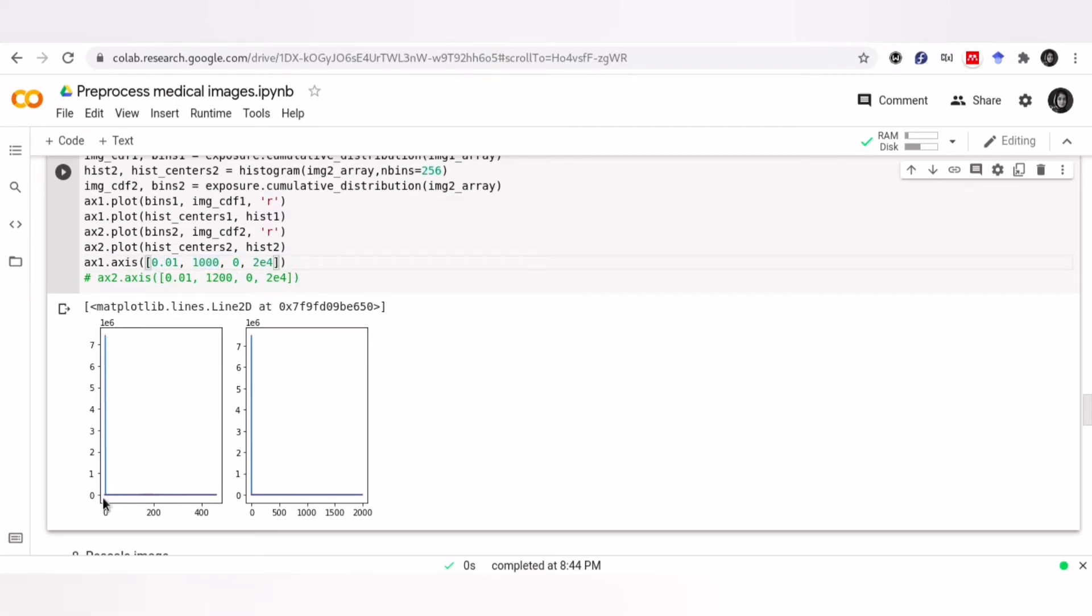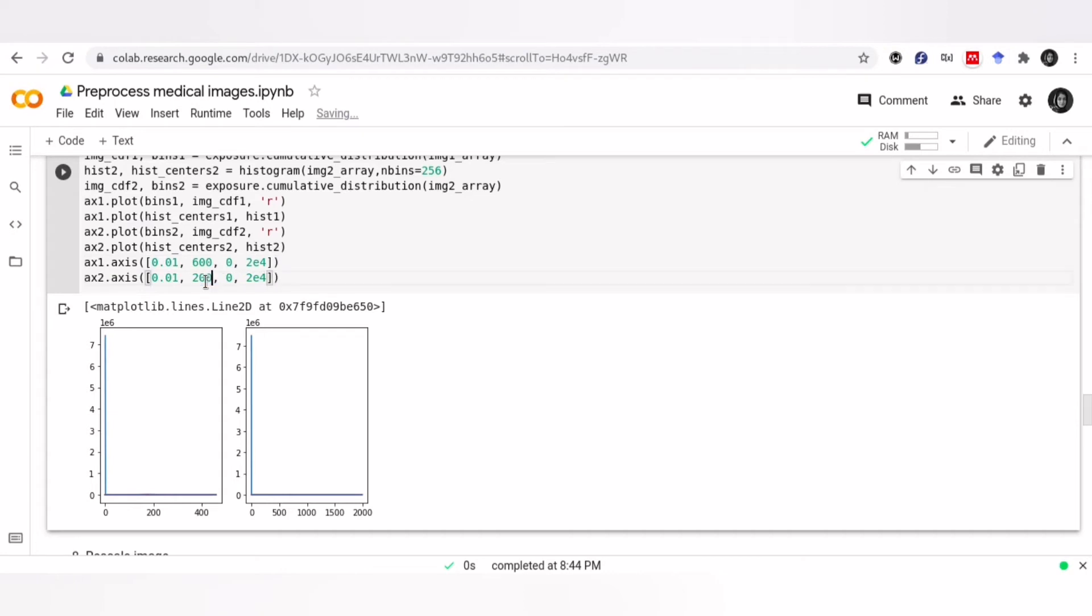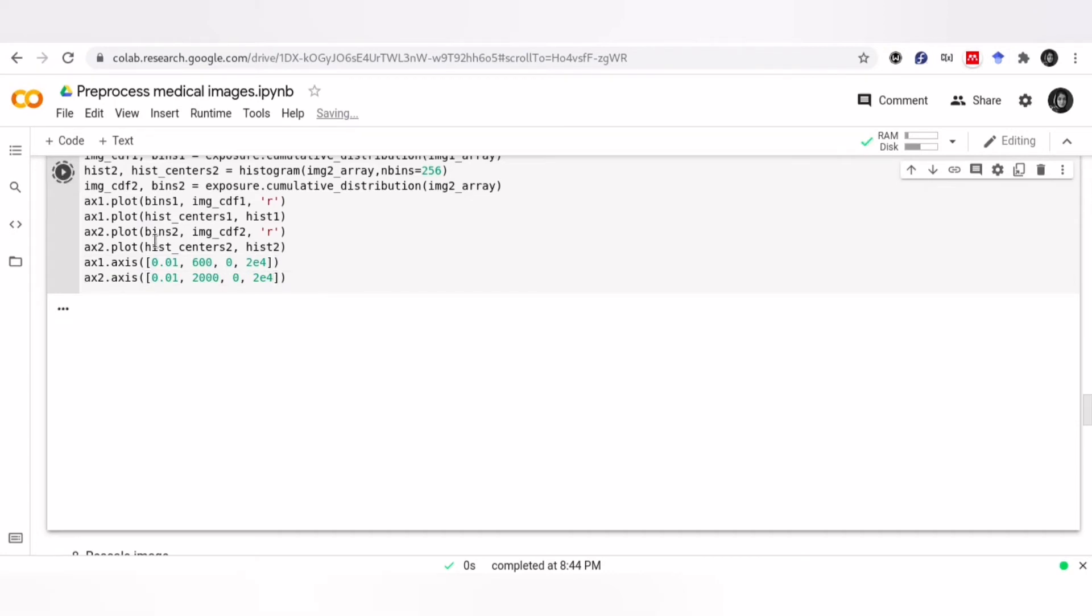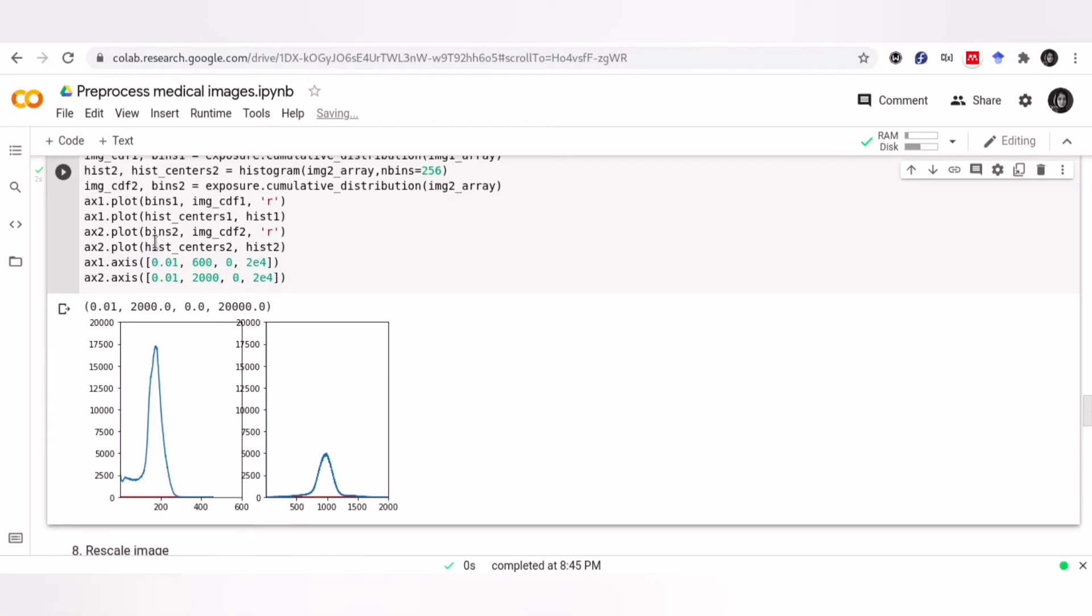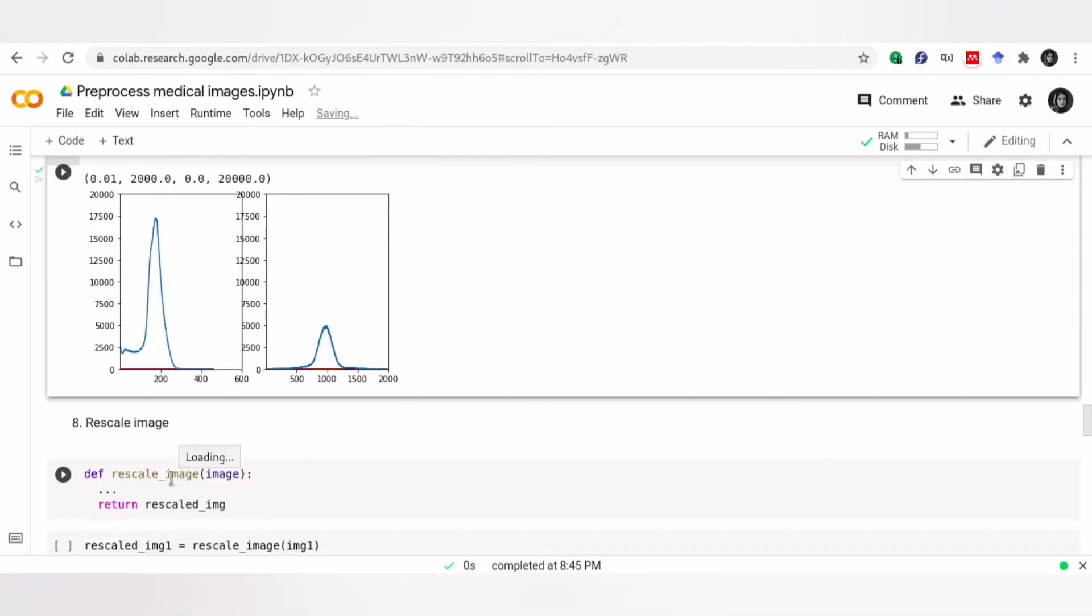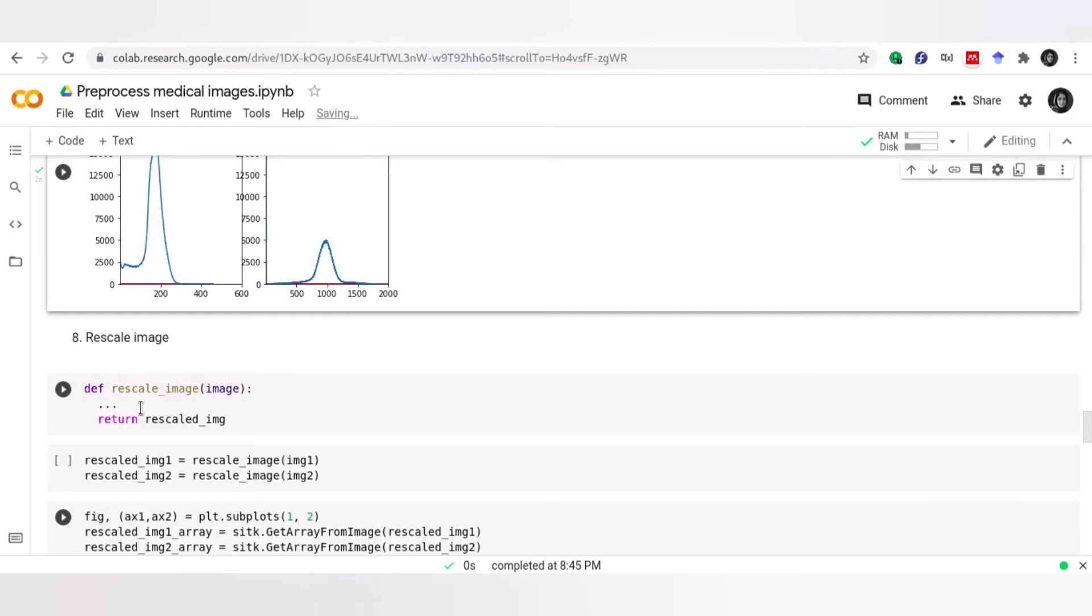Let's zoom to see the histograms better. Here, I ignore zero-intensity voxels, as they show the background. Then, we choose an appropriate range for x and y, based on our plots. Now, our plot is much clearer. So, we use rescaling when our images have different scaling. Rescaling will change the spread of your data, as well as the position of your data points. However, the shape of your distribution won't be changed.